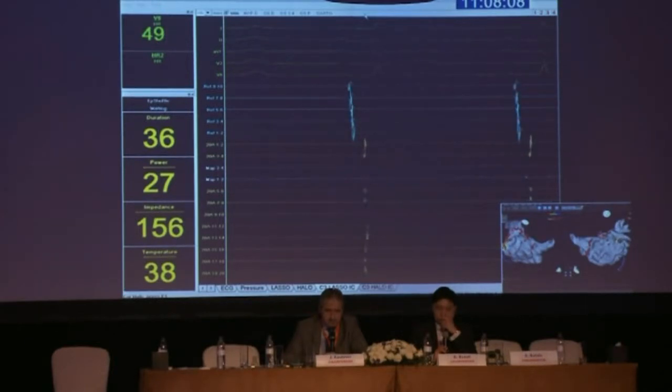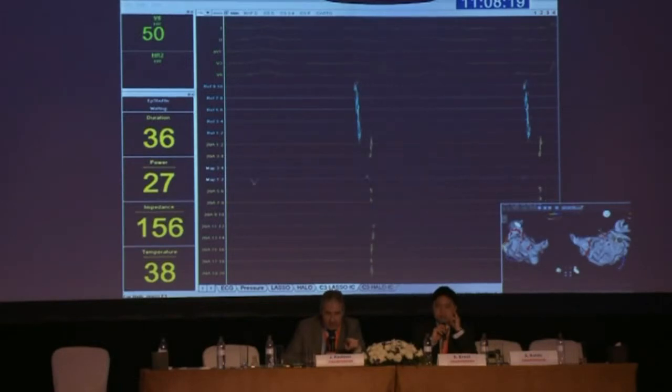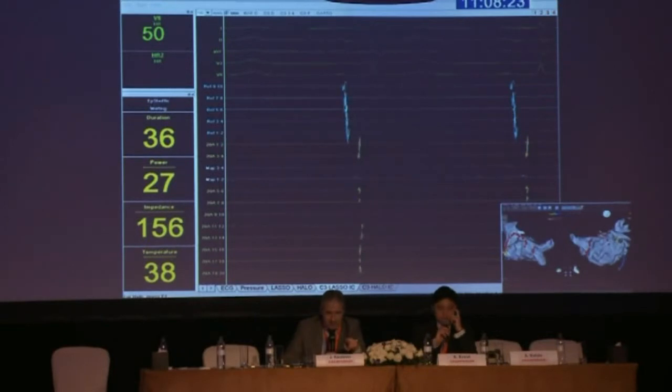And that's clearly earlier than the left pulmonary vein signal. If you look at the signal now from the pulmonary vein and the ablation or mapping catheter, it's quite early now. So that's a mapping of the gap of conduction within the vein.